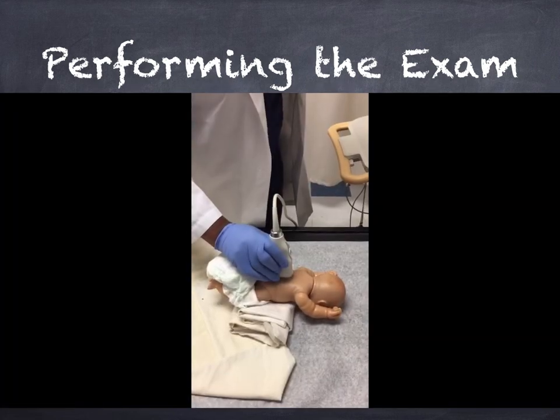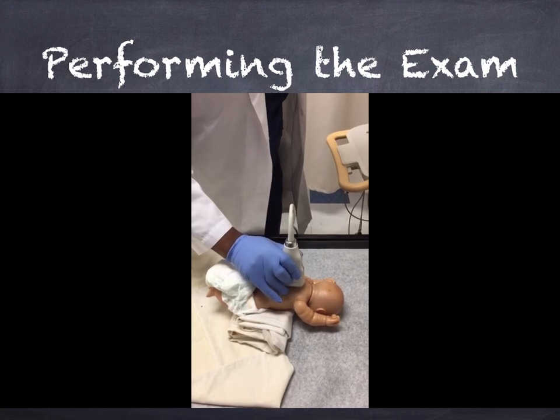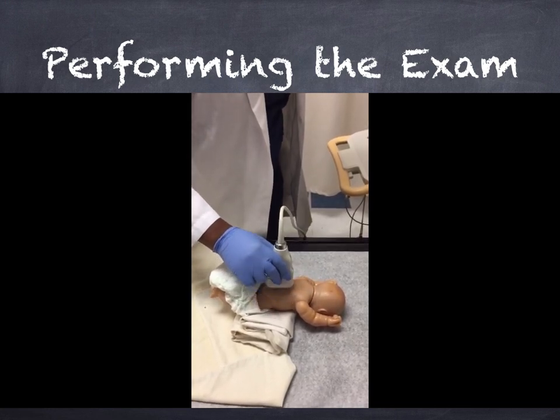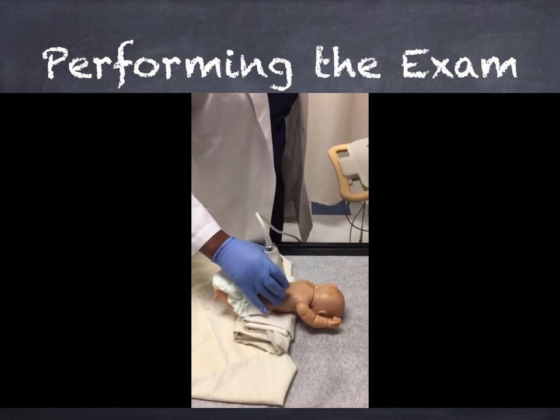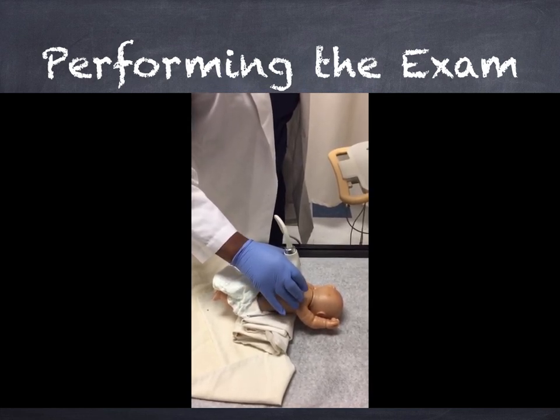With a linear transducer, start in the sagittal position with the notch facing the infant's head. Sweep left to right and up and down, looking for abnormalities or anything that jumps out at you. Then turn the transducer 90 degrees to get the transverse position and sweep again through the spine looking for abnormalities.